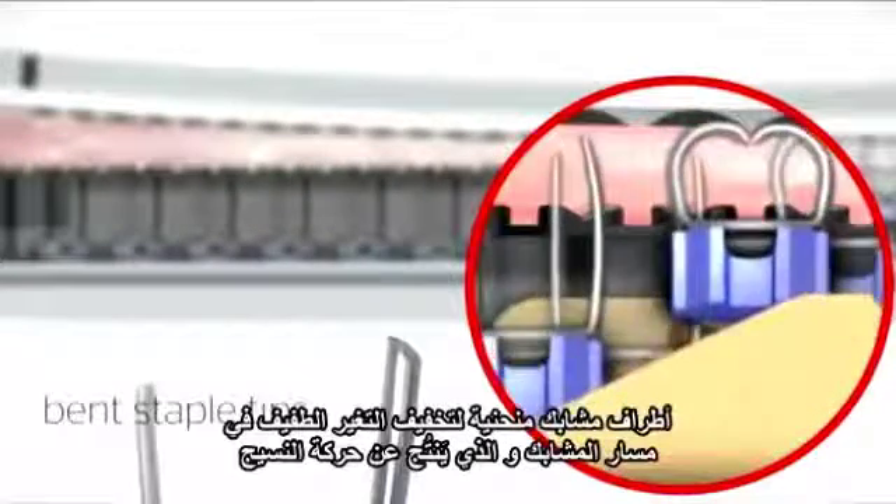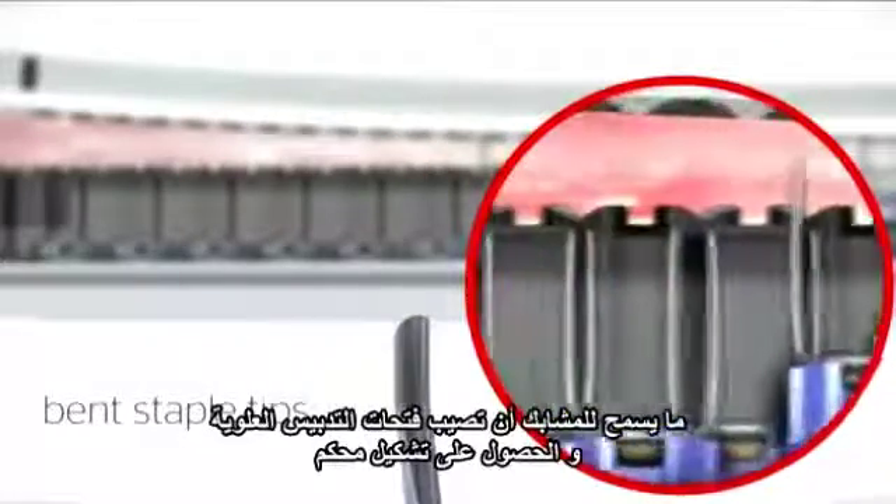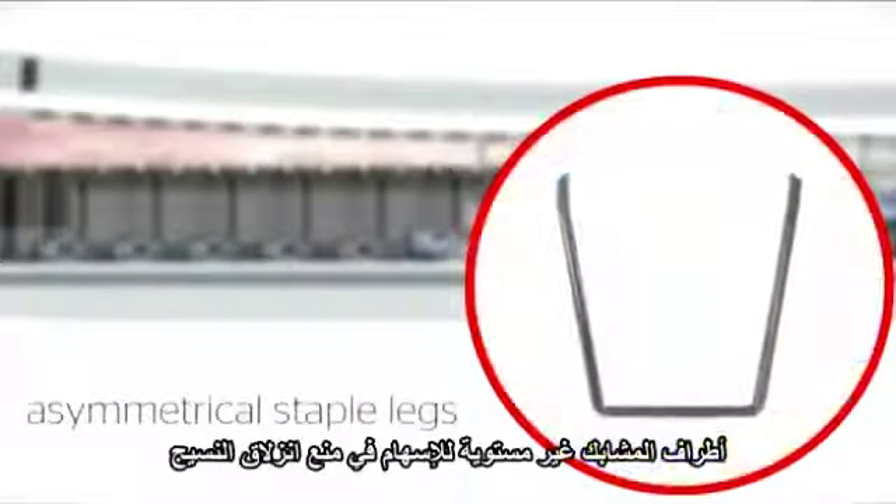Bent staple tips mitigate the slight change in trajectory of staples due to tissue movement, allowing them to hit the anvil pockets for consistent staple formation. Asymmetrical staple legs compensate further for tissue slippage effects on each staple leg due to tissue flow across a wide range of tissue thicknesses.